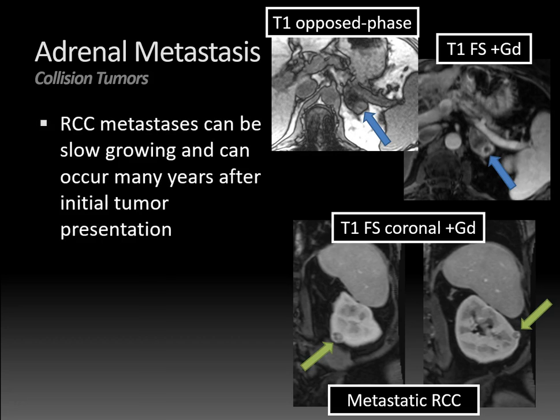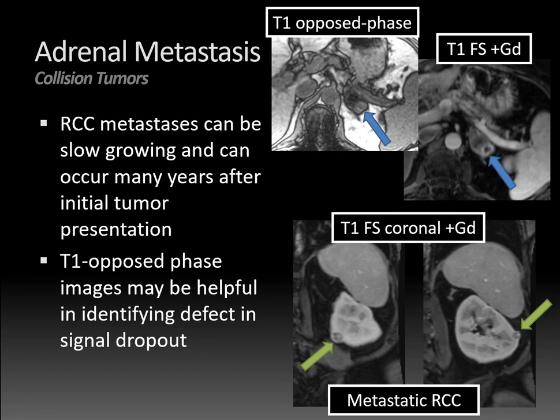Two teaching points from this case: renal cell carcinoma metastases can be extremely slow-growing and can occur many years after the initial tumor presentation — in this case, nine years after the initial MRI. Cases can present as far as 20 years after the initial presentation of renal cell carcinoma. Also, T1 opposed-phase images can be very helpful in identifying collision tumors by revealing a defect in an area of signal dropout — particularly useful on examinations done without intravenous contrast. This same principle applies to identifying lesions within a fatty liver or osseous lesions in the spine, as both will demonstrate signal dropout on opposed-phase images.